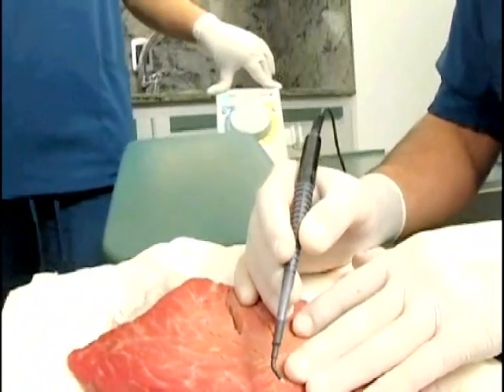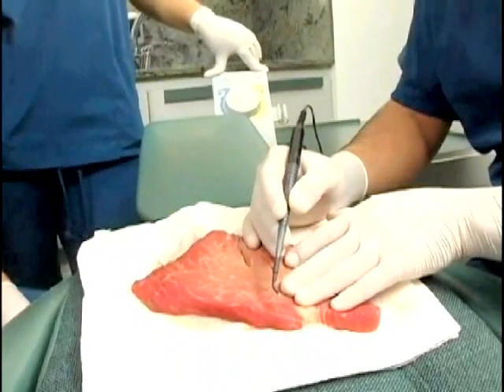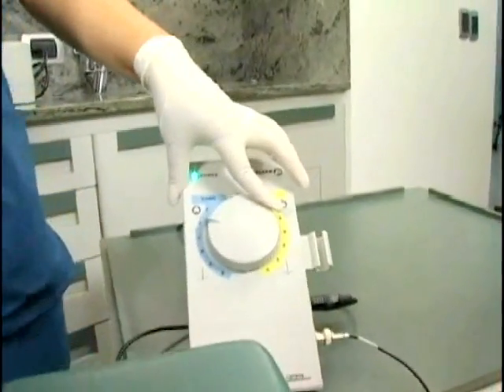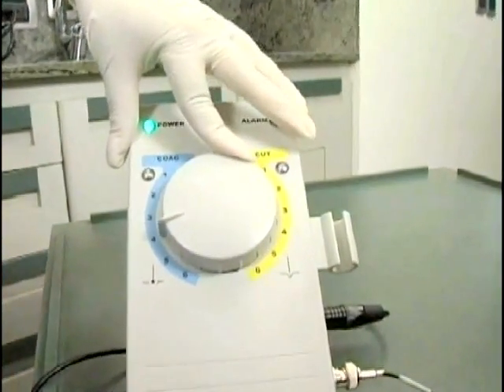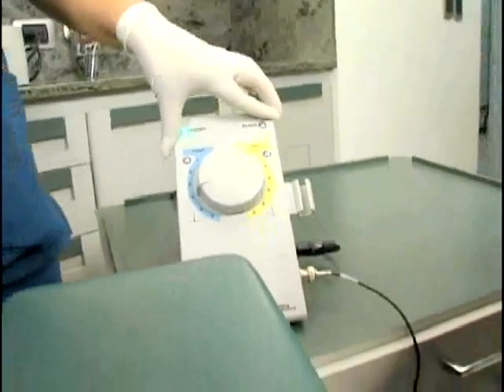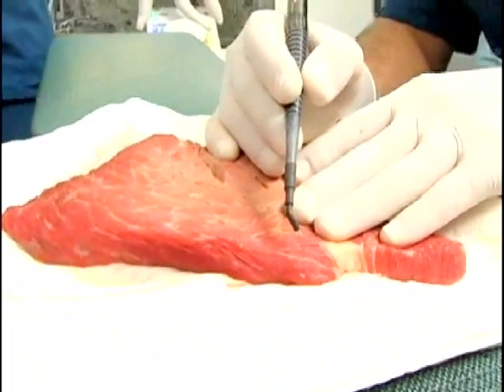Repeat this technique at a successively higher output setting until blanching occurs. When bleeding occurs in association with cavity preparations and retraction cord placements, it frequently delays restorative procedures. With Perfect TCS 2, you can easily and immediately stop bleeding with a touch of the coag ball electrode.